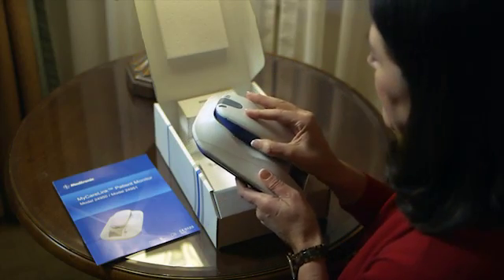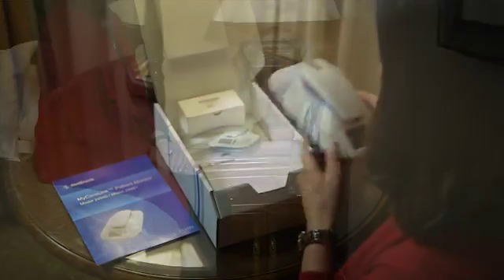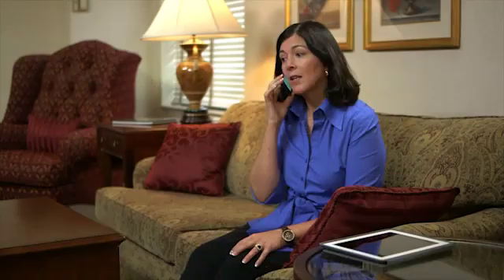After you get home and set up the MyCareLink patient monitor, the system is designed to take care of itself. Your doctor will contact you if necessary or discuss next steps at your next scheduled appointment. Continuous monitoring with the Reveal Link system makes it possible for your doctor to learn about your heart while you're free to live your life.